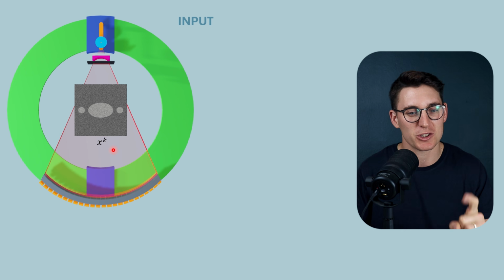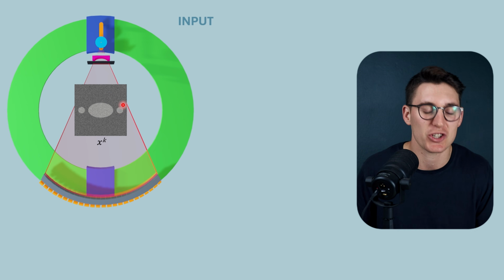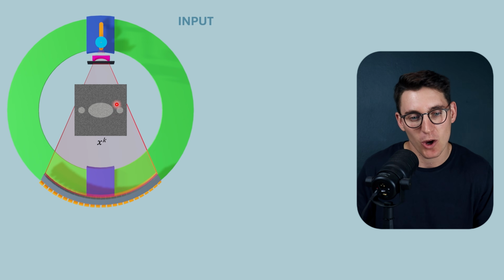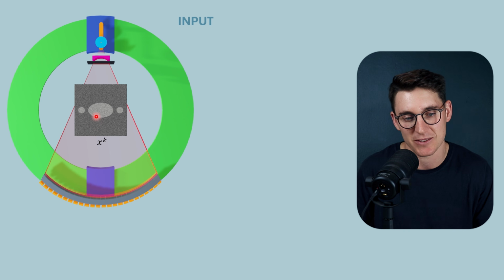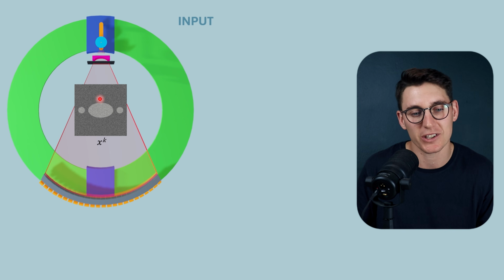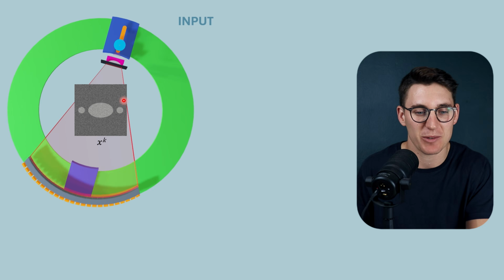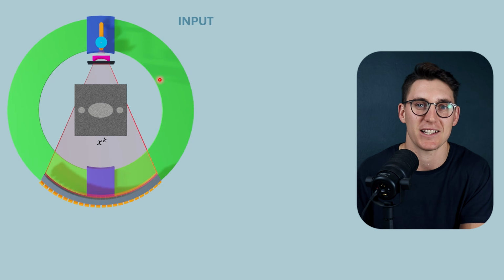And now comes the important part with iterative reconstruction: we can model the data based on the specific CT machine that we're using. We know the width of the focal spot. We know the geometry of the fan beam. We know the differing X-ray attenuation as it passes through different lengths of our estimated image here. This is calculated mathematically. What we're doing is modeling what the forward projection would be. We're also not getting noise here. We don't have actual detectors. We don't have actual X-ray photons passing through our image here. What we've done is mathematically modeled it. So the CT machine is not actually rotating around our image, but it's a good way to think about how we're creating that data.